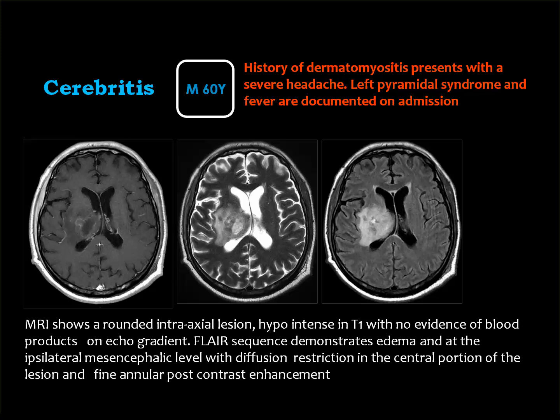If you are confronted by a patient in the stage of cerebritis, you will never be able to diagnose it, and you will go for tumors. But if the patient had enough time for this cerebritis to be transformed into an abscess, then the diagnosis is quite easy. Okay? In our countries, we do not usually see the stage of cerebritis. It is seen only in the West. You get a lesion, and they say we assume that this is a neoplastic lesion, and we go for biopsy. Then the biopsy results appear that it is cerebritis, just cerebritis.